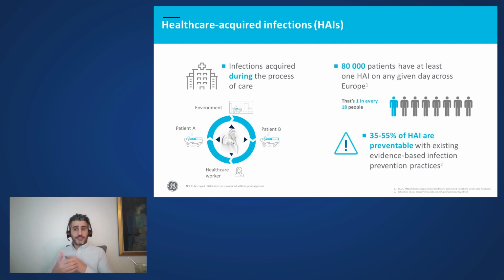So on the patient's skin we might find germs, also on health worker skin we might find germs, and on ultrasound probes. And then in a hospital environment we can also find the susceptible persons, and these are the ones who are not vaccinated or otherwise immune.